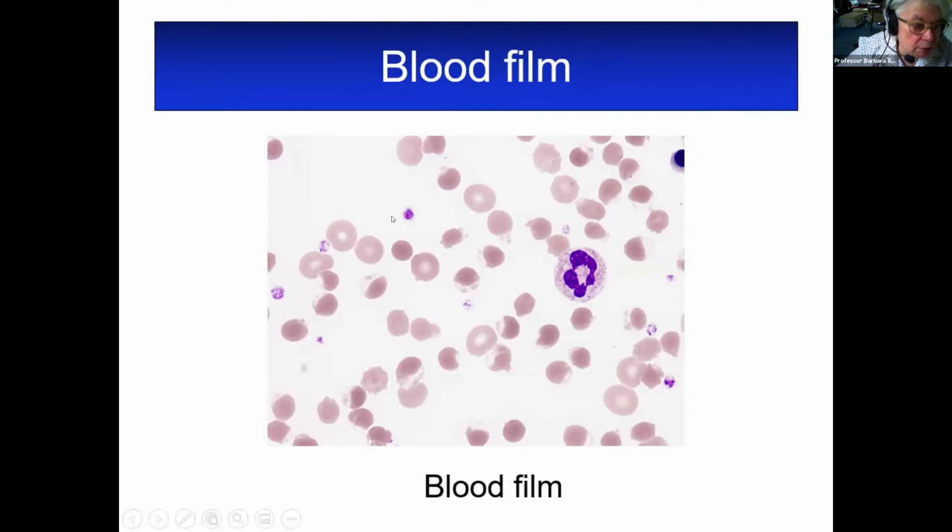There are some fairly large normal looking cells. Perhaps some of these are even a little macrocytic, but they're certainly not small. But then there are a lot of cells which are small and dark. So they've got reduced central pallor or absent central pallor. So you have to first ask yourself, are they spherocytes? Which they're clearly not. There's the odd one that looks roughly spherical, but the dominant one is not. And these are correctly termed irregularly contracted cells. Like the spherocyte, they have a high MCHC.